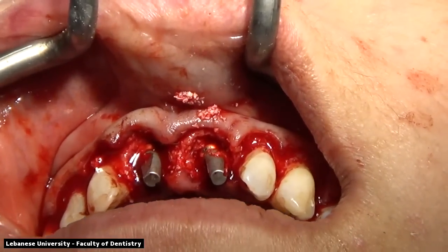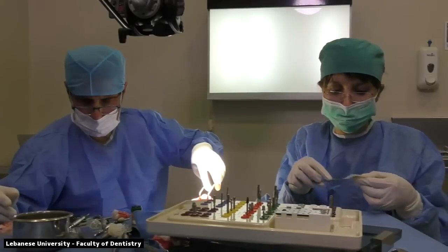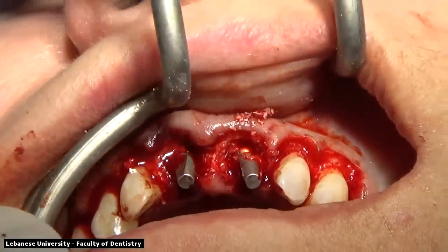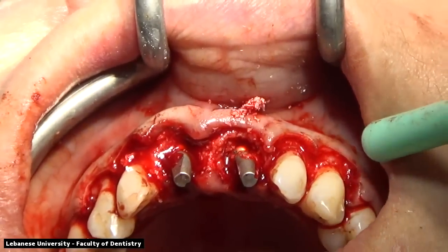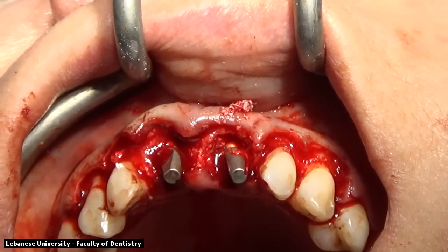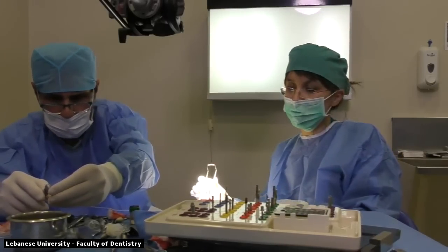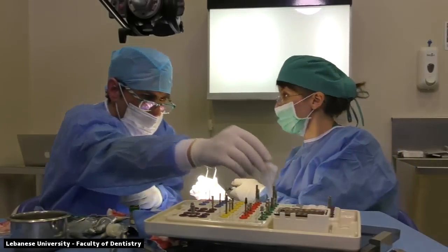We will be cementing the temporary restoration right now. The temporary cement that will be placed has to be in minimal amount, and we have to make sure that we remove all excess cement because cement will lead to bone resorption and bacterial accumulation and microbial leakage. We are cleaning the temporaries right now from any blood that was present at the site.